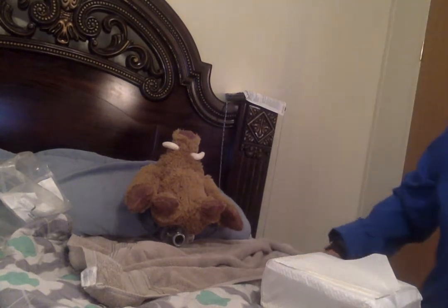This is above my waist, though, so at least we got that going for us. So what we're going to do is open the inner sterile wrap using sterile technique to create a sterile field. Then using sterile technique, we're going to open up the top flap to the far side of the kit.